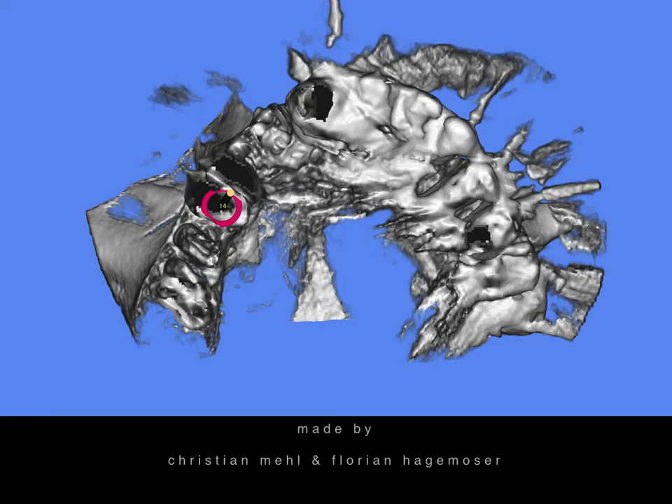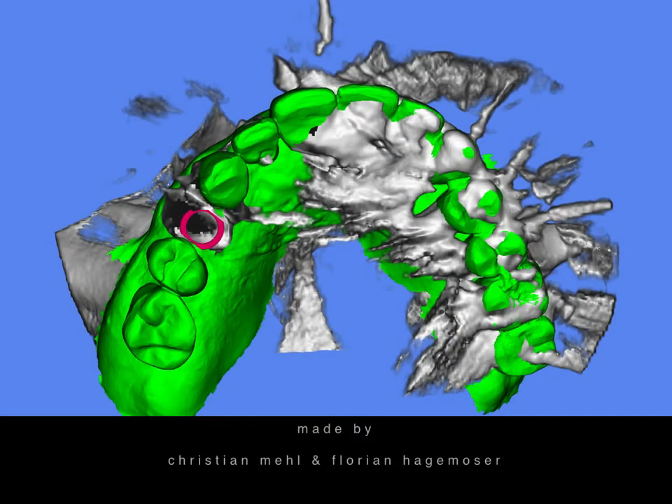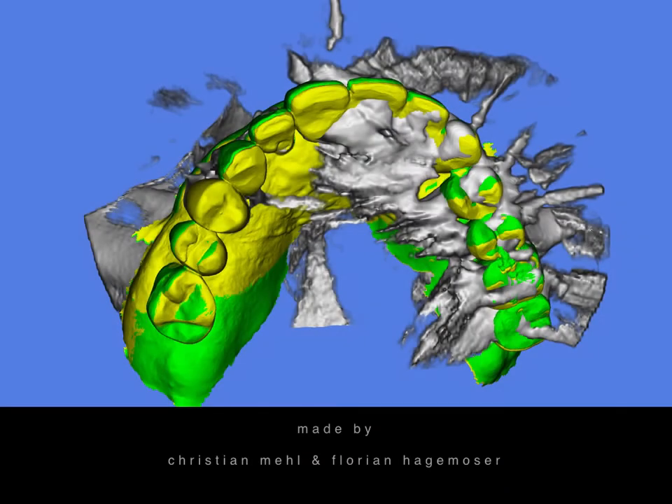In our diagnostic session, which we always do, we take CBCT three-dimensional x-ray, digital photos, and a digital scan. Here we uploaded the CBCT into a digital planning software — in this case it was SMOP by Swissmeda. We superimposed the original situation with the digitally reduced upper right first premolar. Make sure that you reduce it enough because your sleeve needs to be as close to the bone as possible. You can also place a wax-up here if you don't like the original situation.